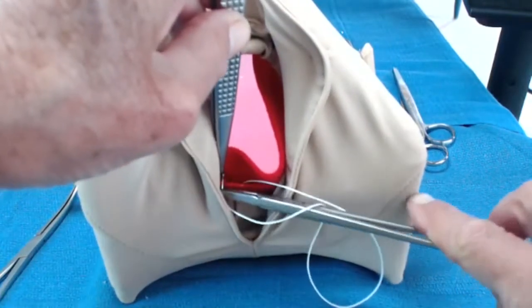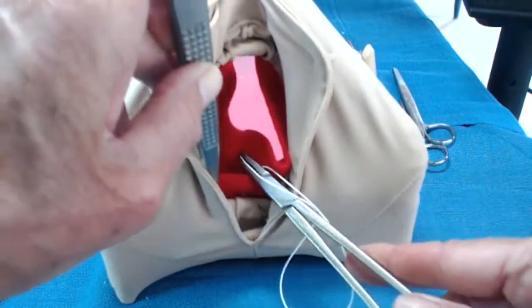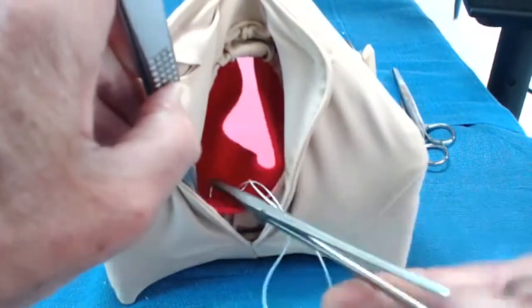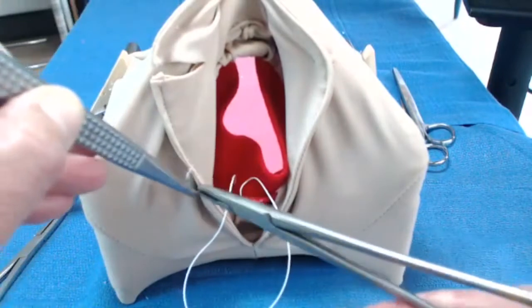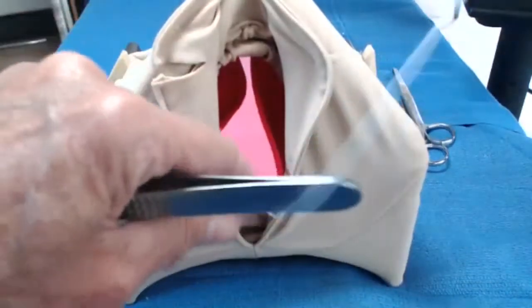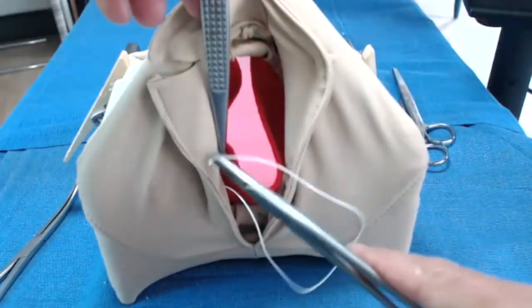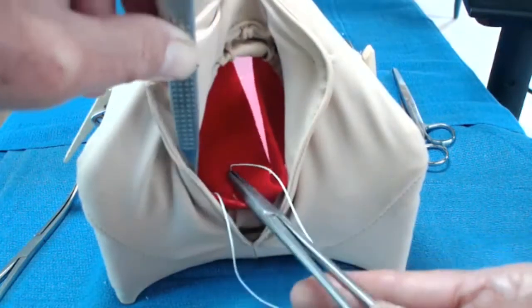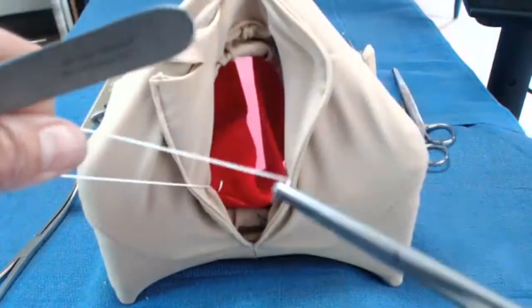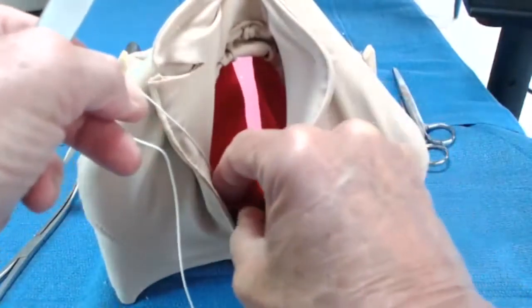If your client has good anesthesia, by all means use tissue forceps to stabilize tissue and provide greater visualization, and do a new assessment after each stitch. You're going to need a relatively small needle to be able to fit in that pocket — usually a bigger needle will not fit. I think I need one more stitch on this side and then I will reassess where I want the next stitch to be. This one was just in the bulbocavernosus.